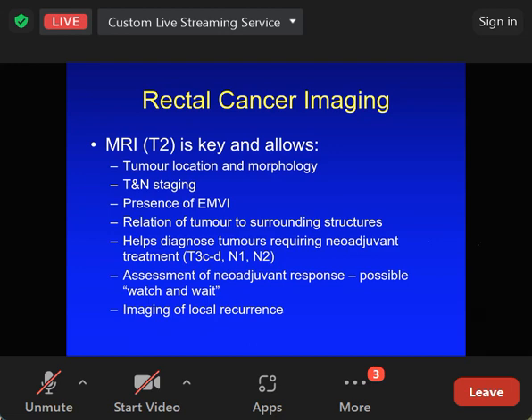And then, of course, arterial ischemia, you have to look very carefully at the enhancement pattern of the loops of bowel. When you pick it up, it's very, very useful. And we had a case only about a month ago of arterial ischemia due to a volvulus, and it was very useful. But I can't give you chapter and verse, but it is a case where if clinically you think there's intestinal ischemia in an acute abdomen and the CT is normal, then it's very important not to think that this excludes ischemia, because it doesn't.